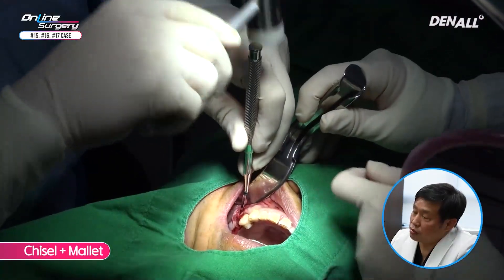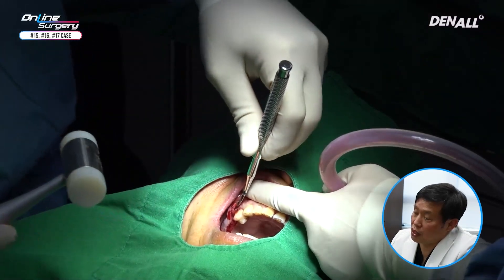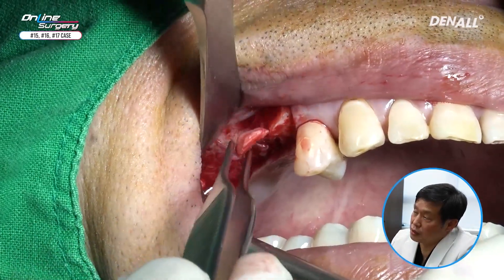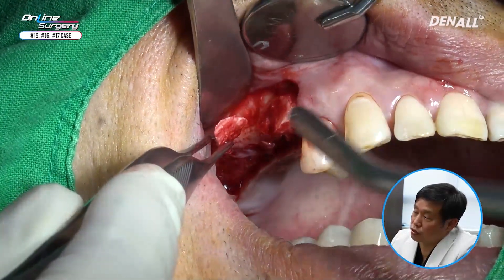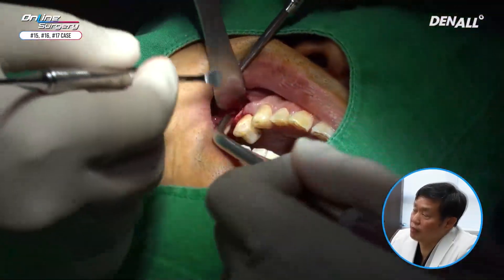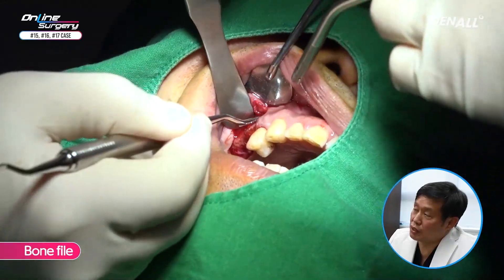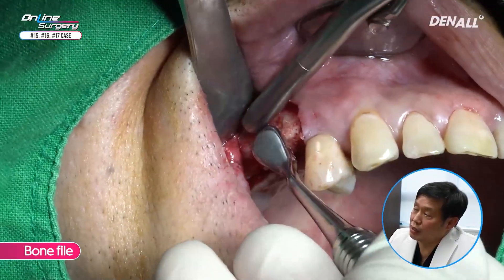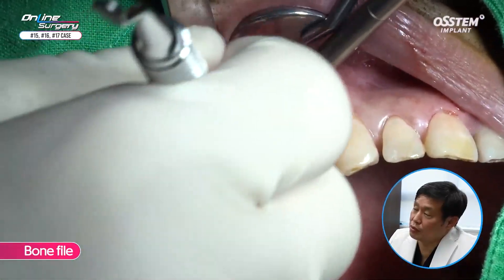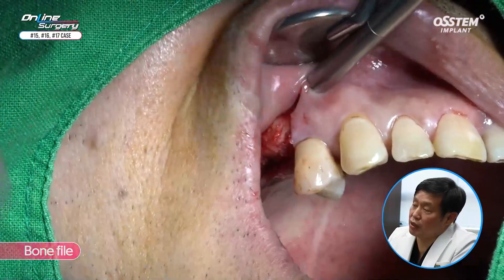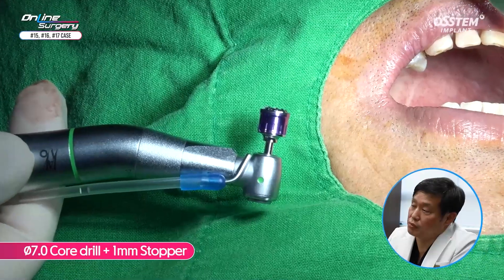I am going to use the chisel to remove the exostosis. If it sticks out like this, in the later prosthodontic phase there can be problems like cleansing. Therefore, as we do surgery, I am going to remove it and use the harvested bone for graft. Chisel is used to remove the bony tissue. Because there are still sharp areas, a bone file is used to make it smooth. This needs to be removed for smooth prosthodontic phase and for self-cleansing.